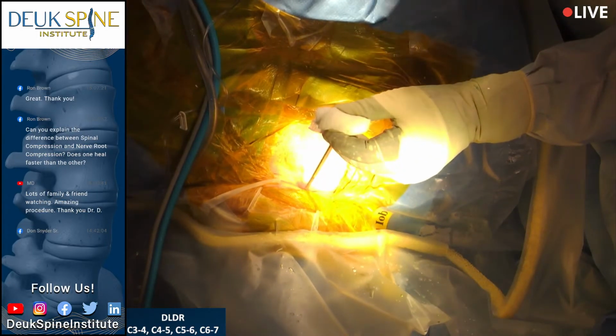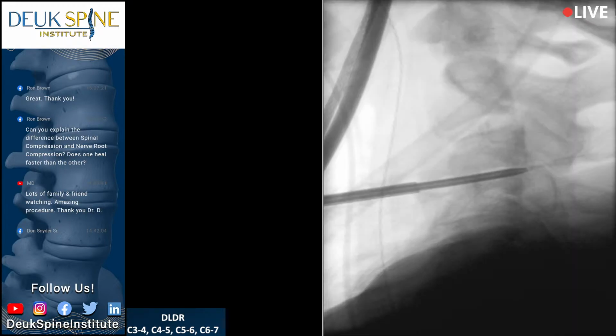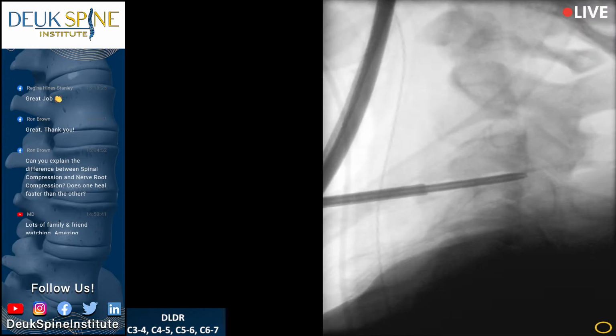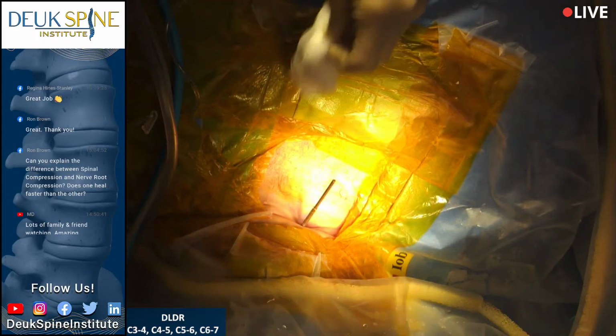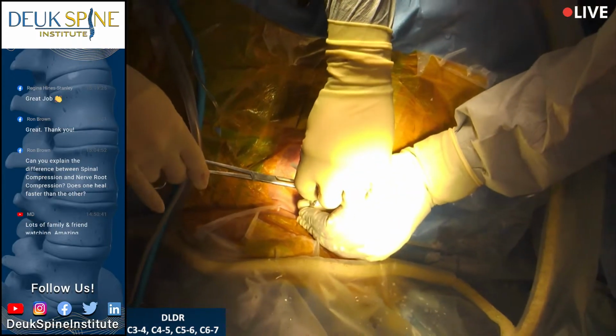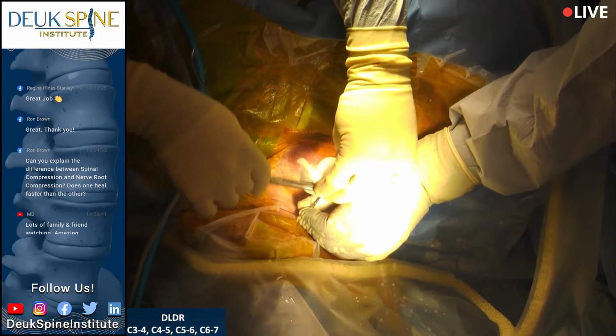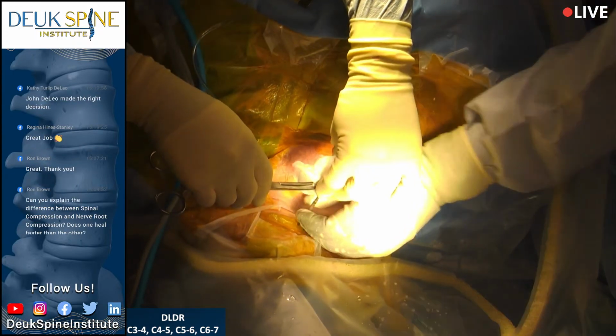Shot. Now, it would be good for you to help me here. A little inline traction. Let me know when you're ready. Shot. I gotta watch that dilator. I'm gonna bring the dilator back just to be safe. Luis, maybe you can help me with the dilator. I just want to pull it back a little bit. I don't want it to go forward, so I'll hold the tube. Just wiggle it back a little bit. Tell me when it's good. Yeah, shot.